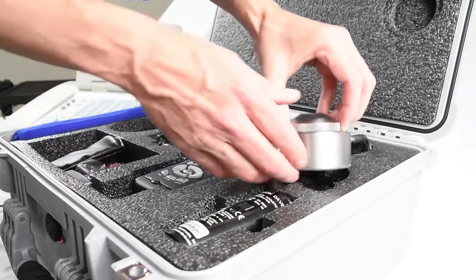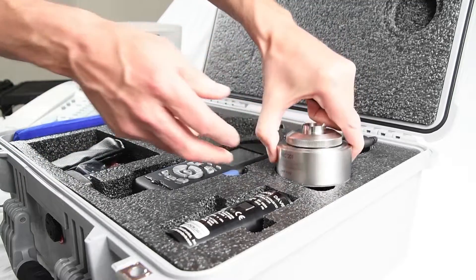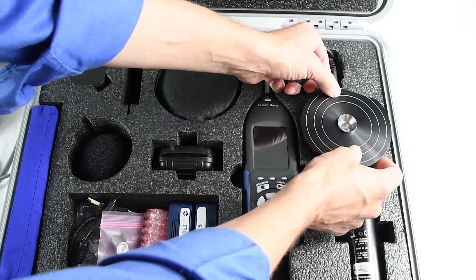In addition to testing bone vibrators and sound booths, OddCal tests with supra-aural, circumaural, and insert transducers.